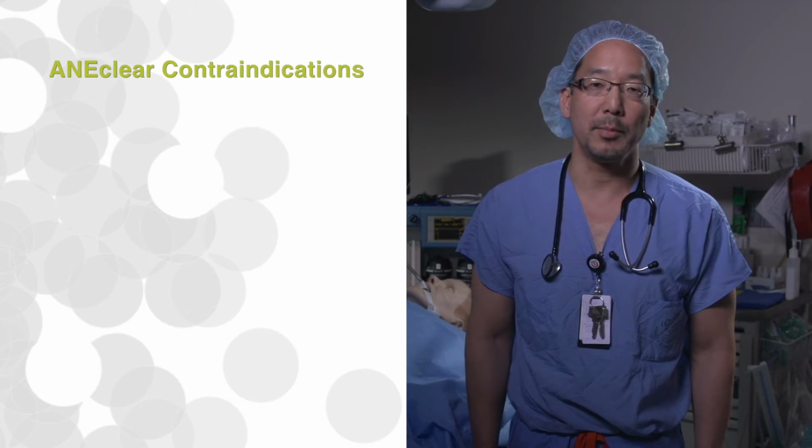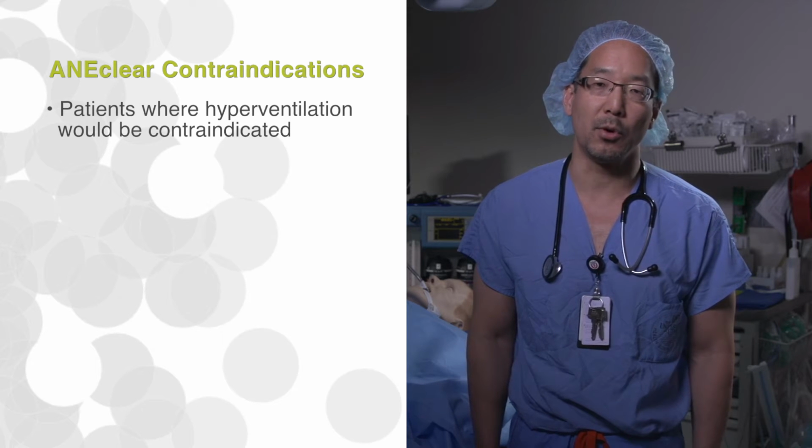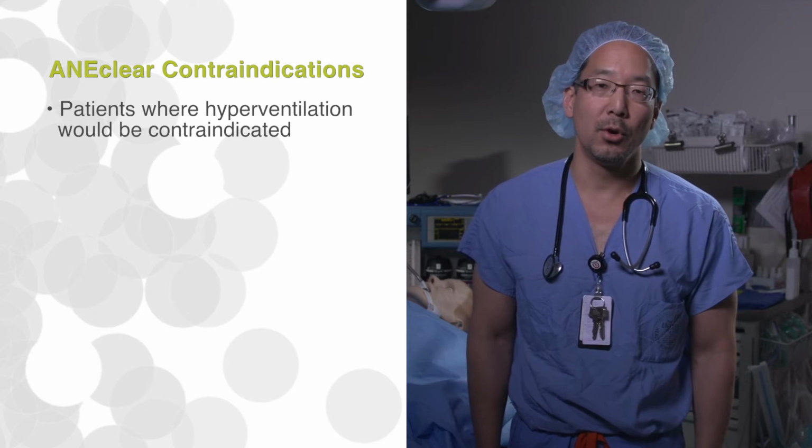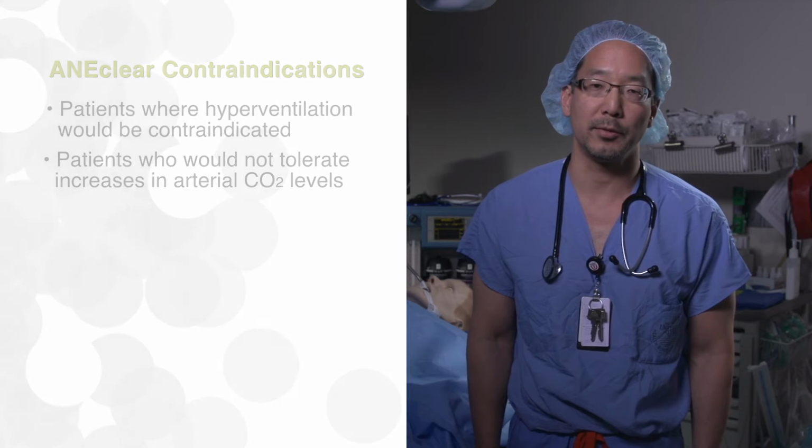This device should not be used with patients in whom hyperventilation by either increased tidal volume or rate would be contraindicated, or in those patients who would not tolerate increases in arterial carbon dioxide levels.